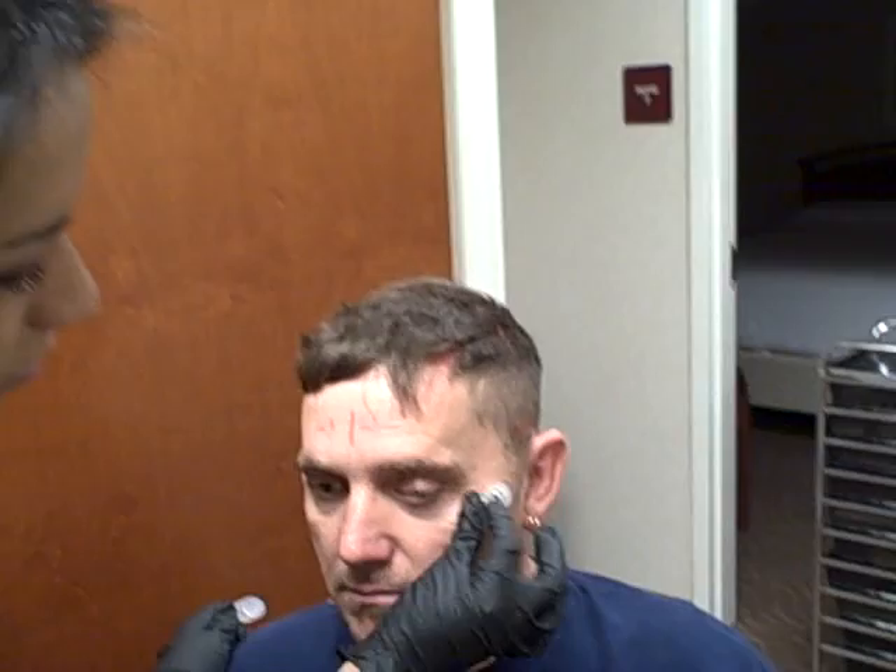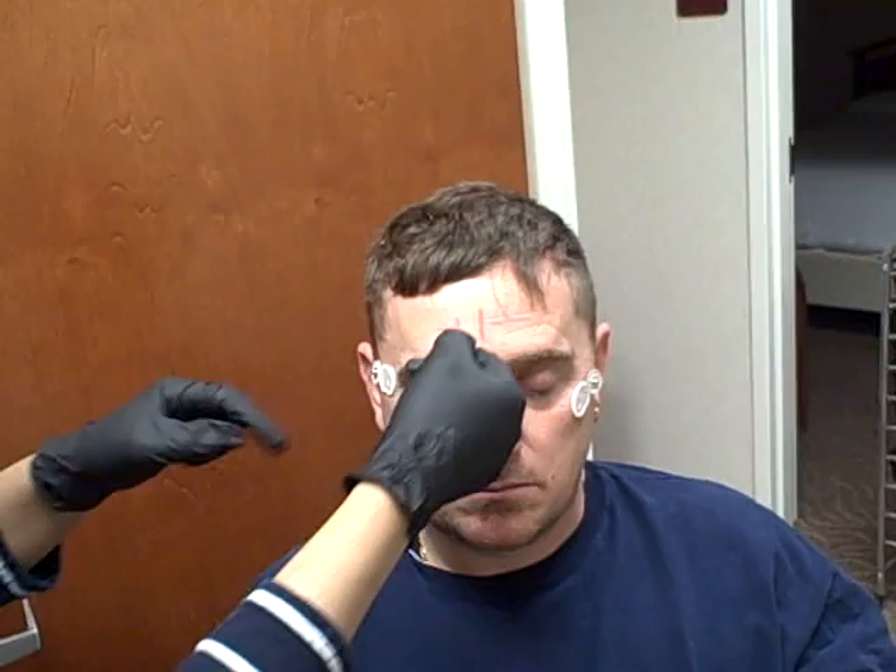Circle the patient around — this is for the patient's right eye, and this is for the patient's left eye. We use these markings up here as our reference and ground.